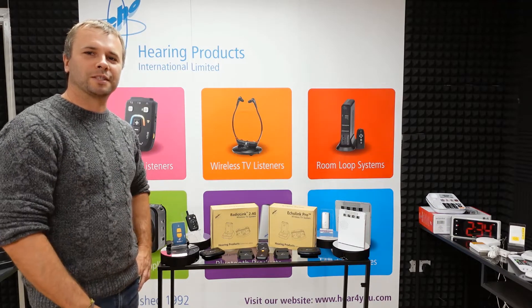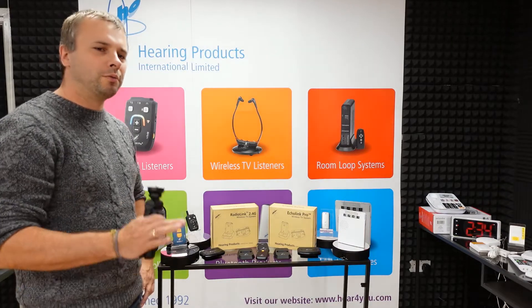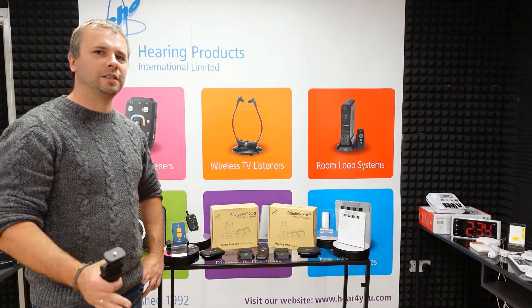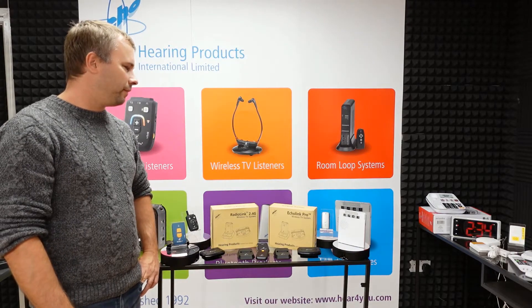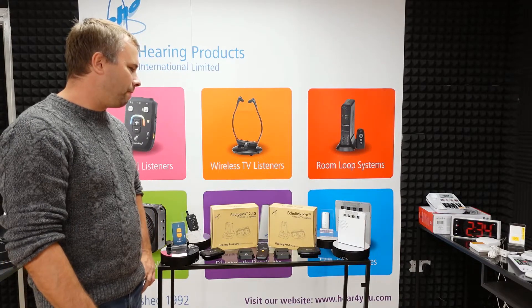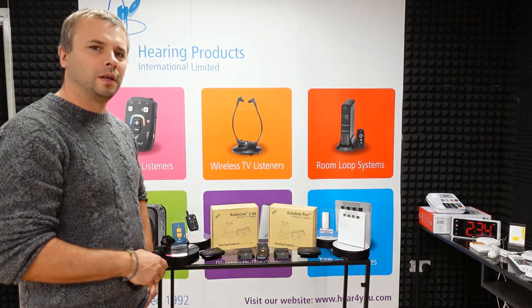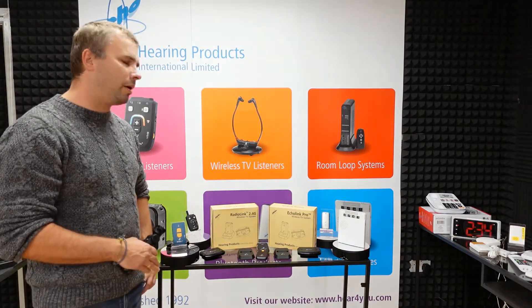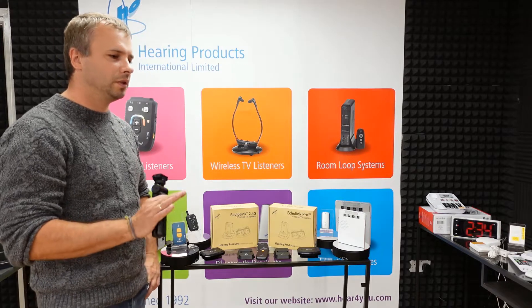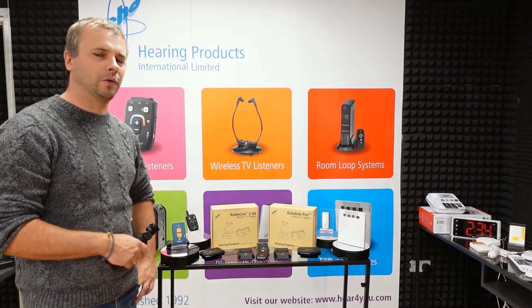Hello, it's Greg from Hearing Products International and today I would like to talk to you about our latest TV listener called Echolink Pro. Echolink Pro is now in stock, available on our website, or if you want to place an order over the phone that's perfectly fine. You can also send us an email to info@hereforyou.com.